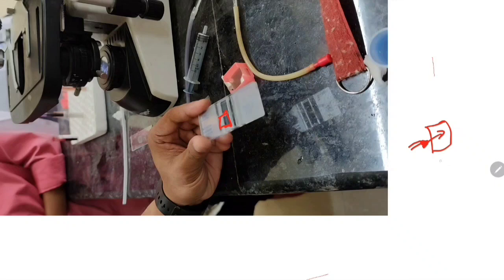Make sure that it is neither overcharged nor undercharged. In both conditions, your count will be lower. Undercharged, obviously: the full area is not charged, you are charging less area, so obviously the count will be lower. But even if you are overflowing this area by putting excess fluid, in that case also your count will be lower. How is it possible? Yes, it's possible because cells are heavier.